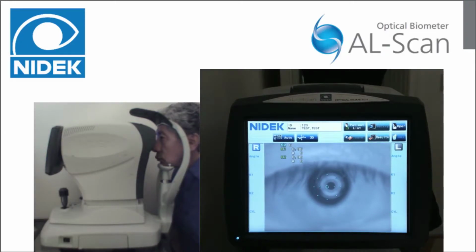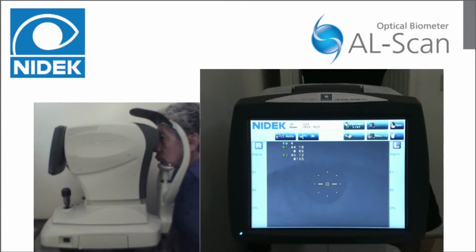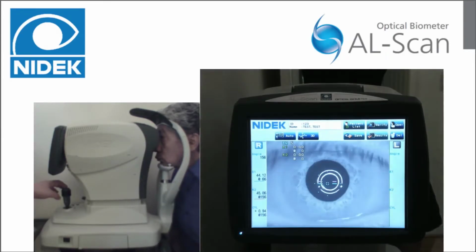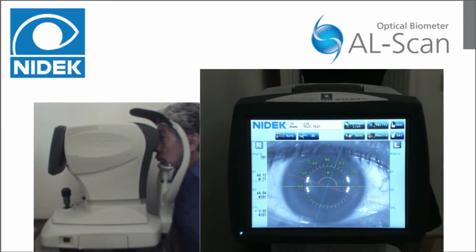Using the joystick, move towards the patient's eye until the auto alignment takes control. Remove your hands from the device. Tell the patient to blink and open wide, look straight ahead at the red dot, and keep open as wide as possible until complete. Once captured, an anterior segment image will be displayed.